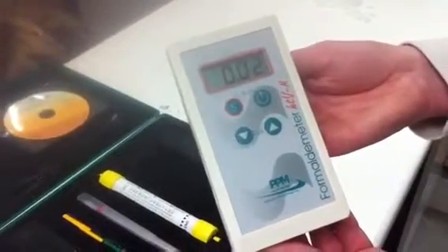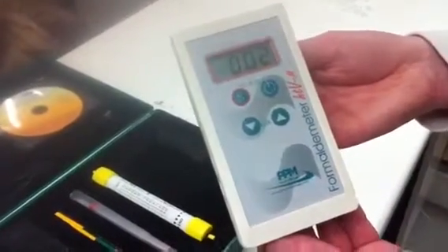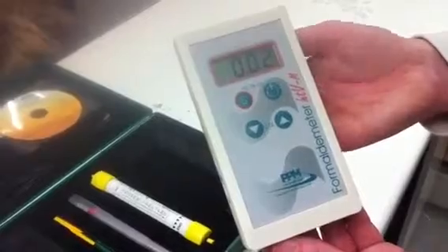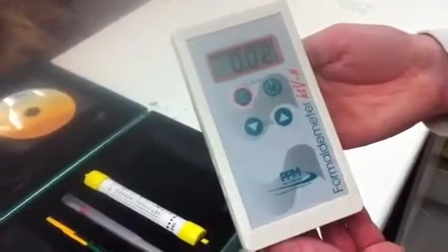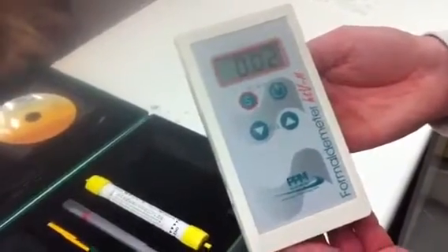That's 0.02 ppm. If the reading had been above the ceiling limits, then a little buzzer would have sounded.